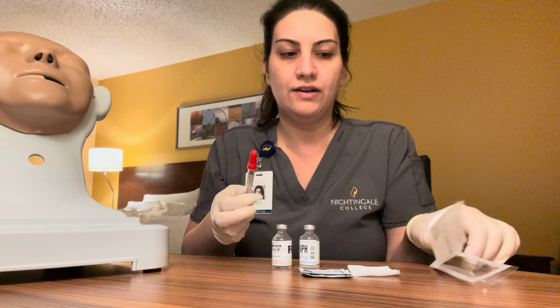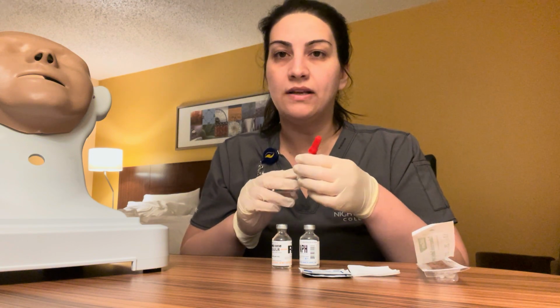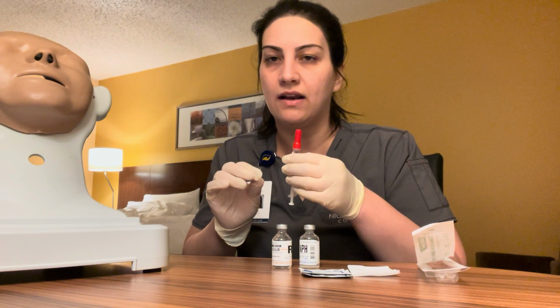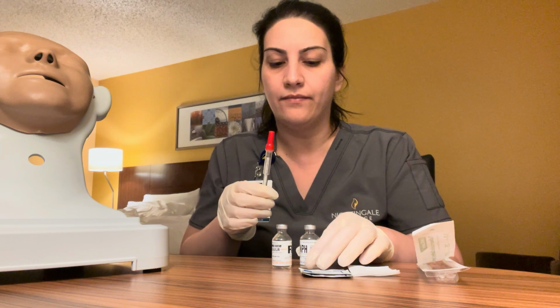So first we're going to draw up air of 8 units of intermediate. I'm not going to draw up the solution. I'm going to push the air into the intermediate.